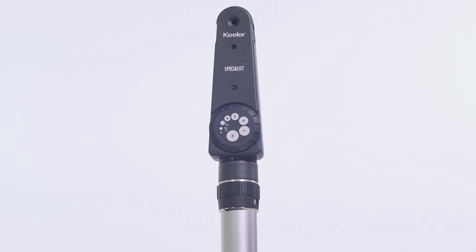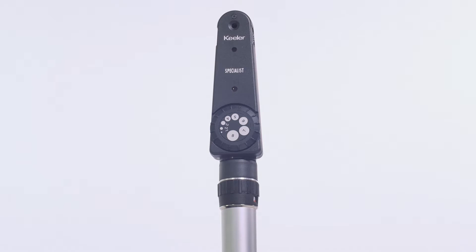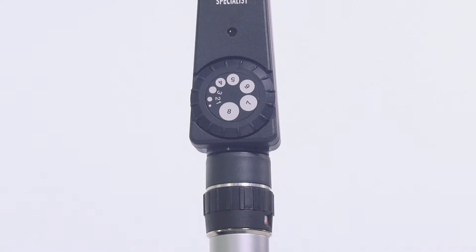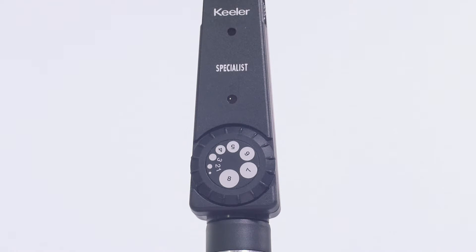The Keeler Specialist Ophthalmoscope is the most precise and versatile ophthalmoscope. It features individual ground glass lenses and additional features such as a pupilometer comparison disc.